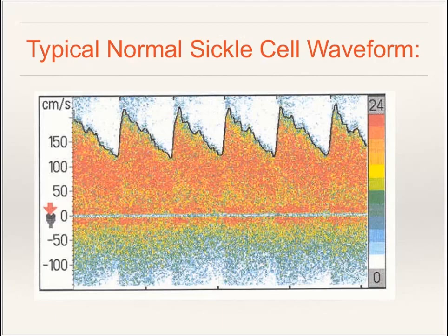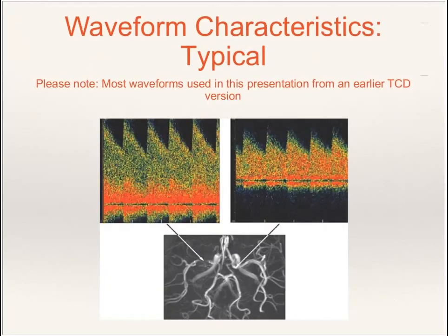So it's important, and this is something that will come in time, and you will see as I show you examples of the TCD waveforms throughout the studies, you'll probably look at them and say, wow, they're way overgained. But if you look at the background noise, you'll see that there's just a tiny little bit of background noise. And we found from trial and error, trust me, trial and error, that having enough gain was really important to be able to optimize the signals.